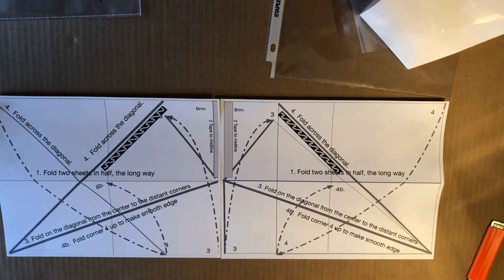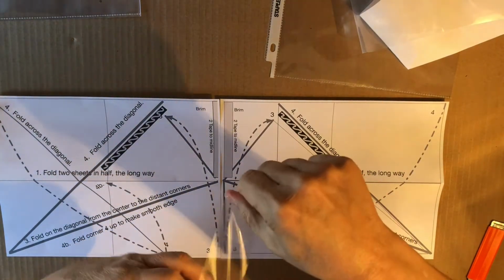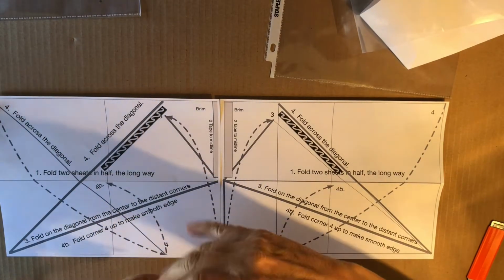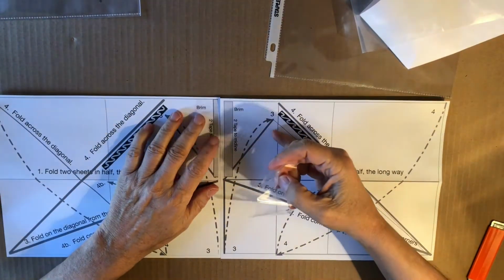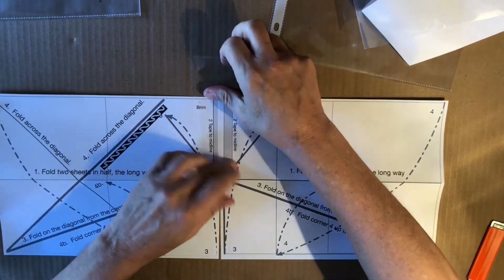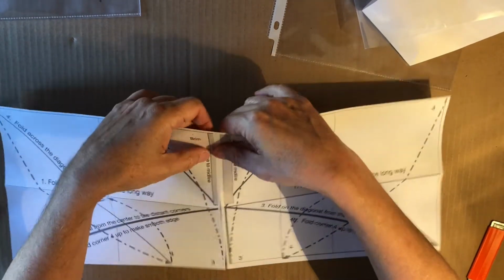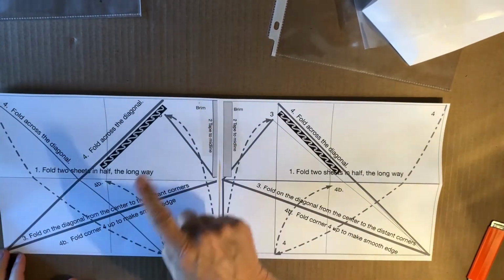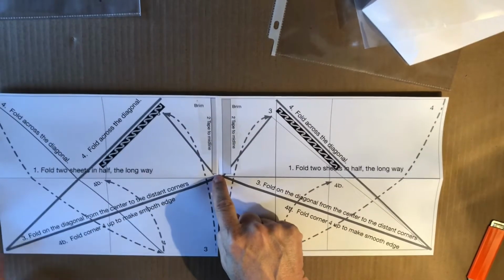And for that, I am finding that hefty packing tape is confidence inspiring because it's tough, too tough, that tough. Okay, so we line this up. We put this down. Now, as you can see, this side is the brim. I don't think there's any harm strengthening the brim further, because that's the only structural element holding these two pieces together.